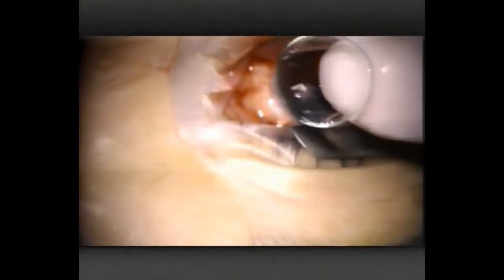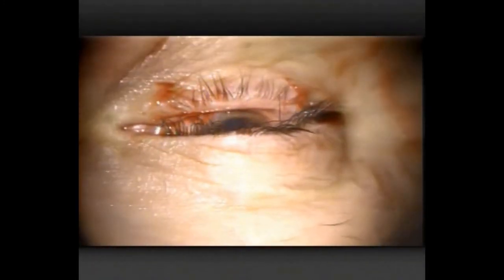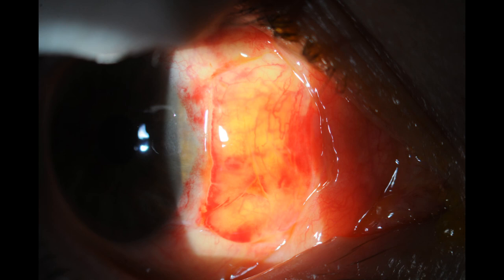Thanks very much for watching. It's a routine case — it's not tricky or difficult, it's just the way I do it, so I thought I'd share it. Thanks again. Here's a post-op photo with a bit of fluid accumulated under the graft, and after suture removal and drainage of the fluid, the patient's quite comfortable at two weeks post-op.